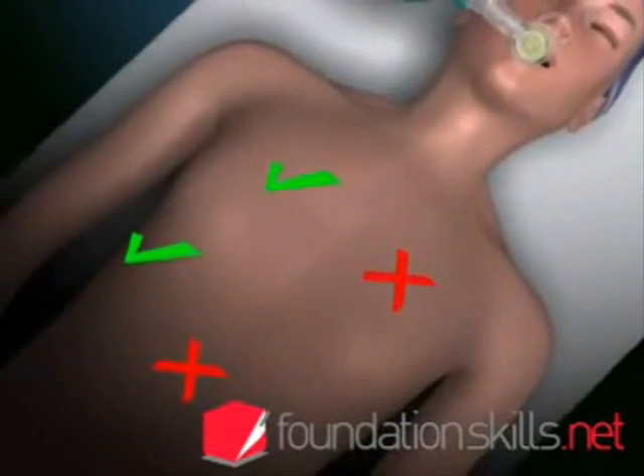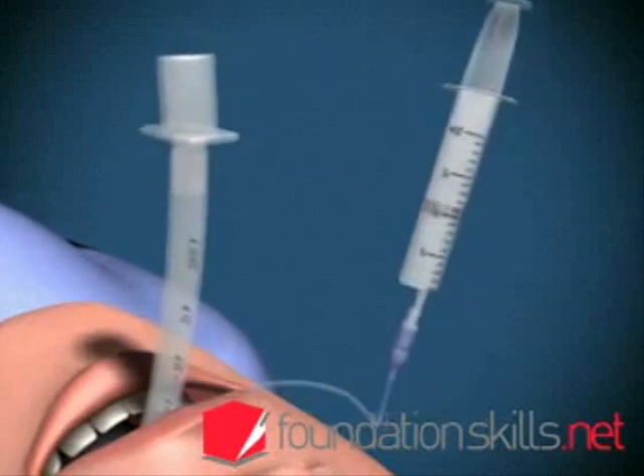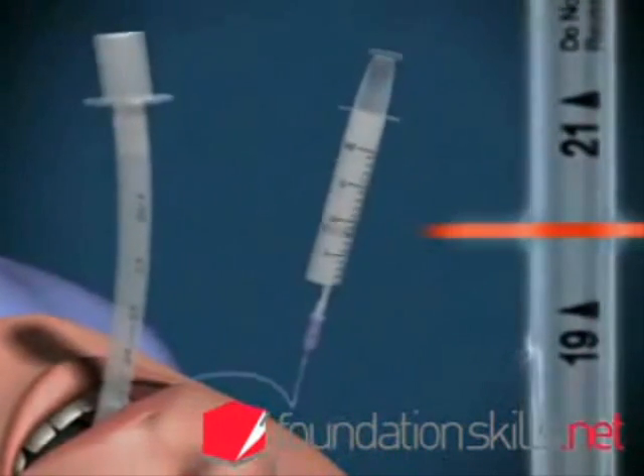If the tube is in too far, the right lung will be ventilated only via the right main bronchus. If this occurs, deflate the cuff and withdraw the tube 2 to 3 centimetres.